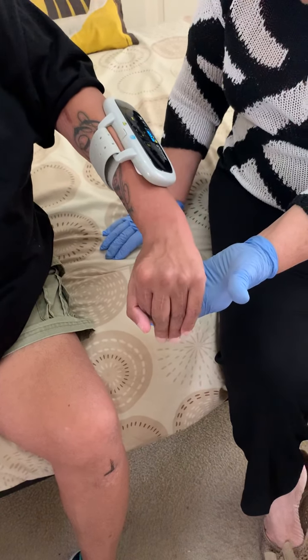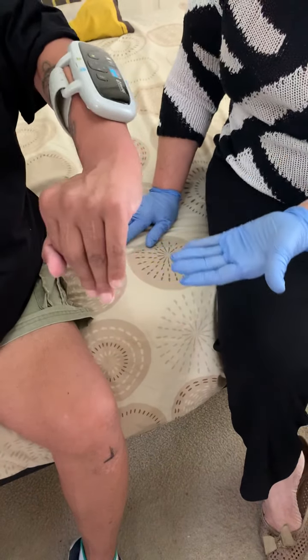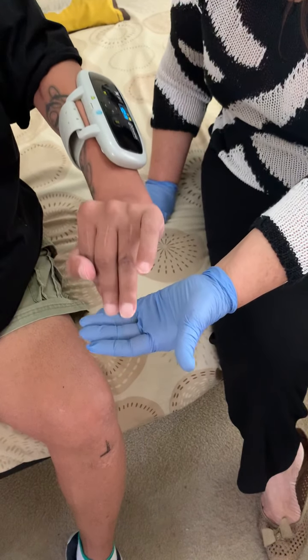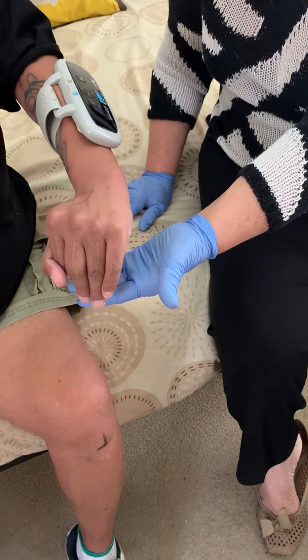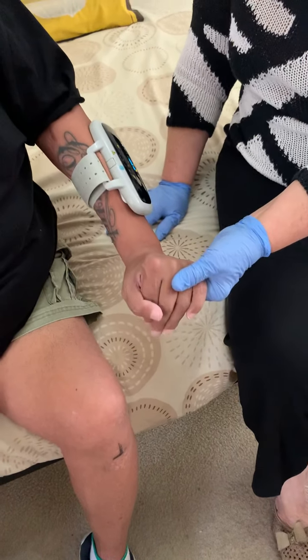Open my hand. You're moving. Reach out. Reach out. Reach out — I can't with my shoulder being so... Just reach. Grab.